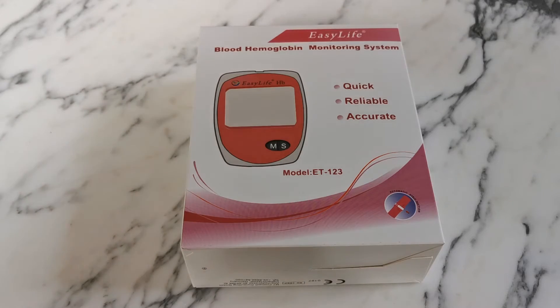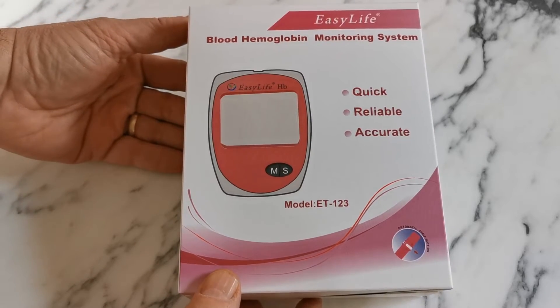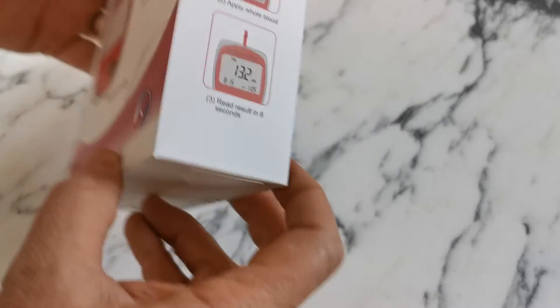Welcome to this Valumed presentation of the EasyLife haemoglobin blood meter system. This is the box pack that you will be sent if you order from the Valumed website or our other outlets. It contains a digital meter, the batteries, a starter pack of test strips, a lancing device, some lancets, and the batteries for the meter — everything you need to get the meter up and running.